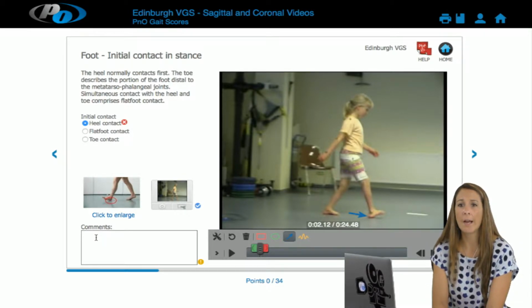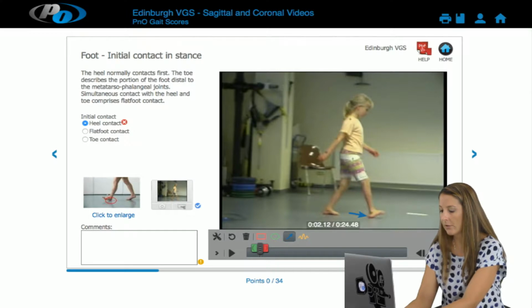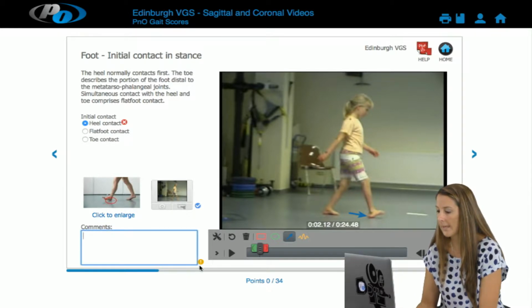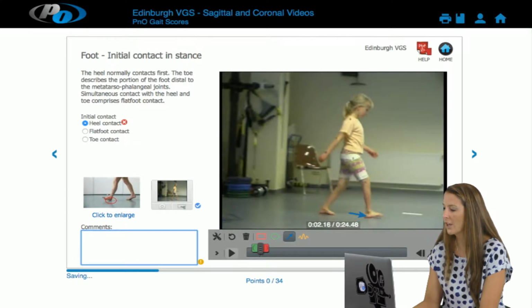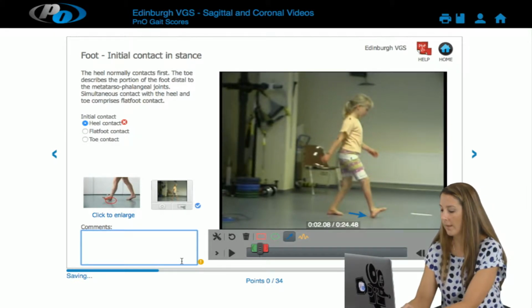If you have more time, which I don't want to take up too much time in this webinar, but if you have more time, you can put, increased dorsiflexion, and we'll see, oops, I'm not in there. Yeah, there we go. So we can actually start to look at a few slides before and after as well. So we can see that, yes, she's in increased dorsiflexion, and then she actually has a rapid plantar flexion. So we can just make note of that.